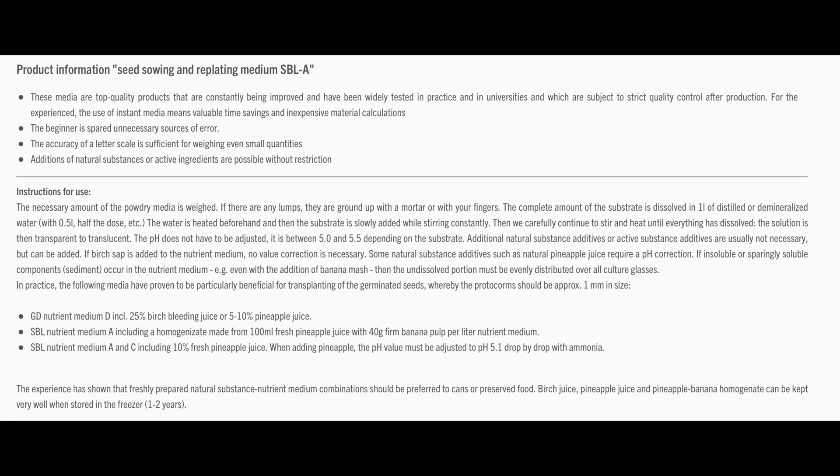Basically the website — Equigenera's website — says to just mix this with water. This amount is for one liter; I'm just going to use half of it for half a liter. They say you can add some additional supplements like banana puree, birch sap, or pineapple juice. But if you use pineapple juice, you also have to adjust the pH because it's very acidic. They also say you don't really have to add anything. So I'm just going to be lazy and not add anything, because the more I add the more complicated it gets. I just want to see: does this work at all? I already have some distilled water here and I'm just going to mix it.